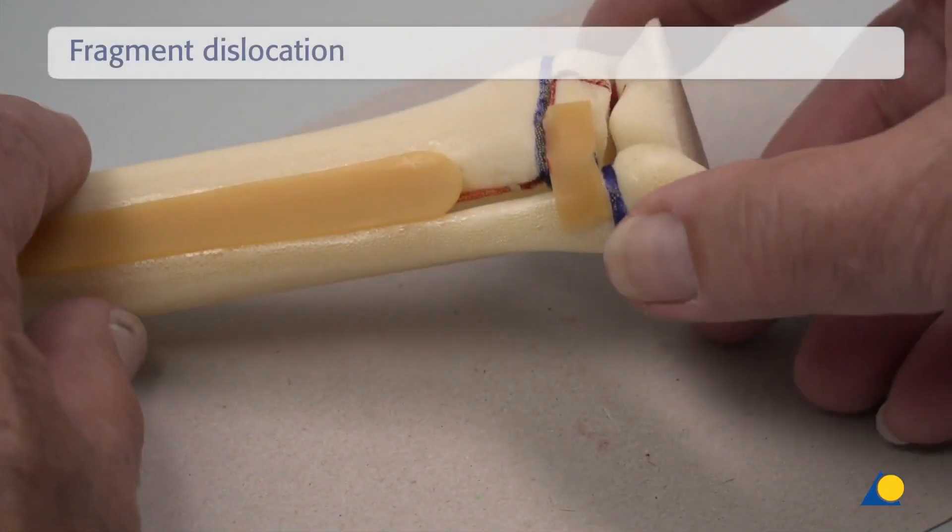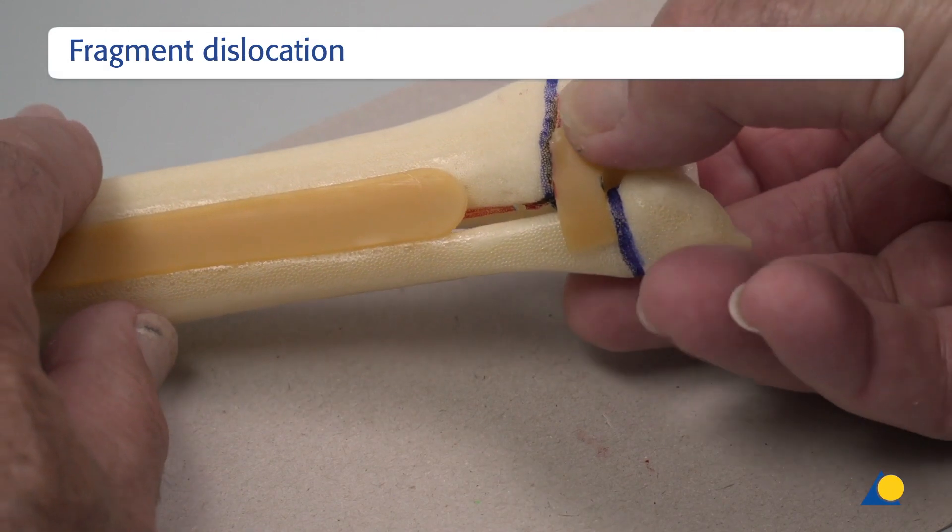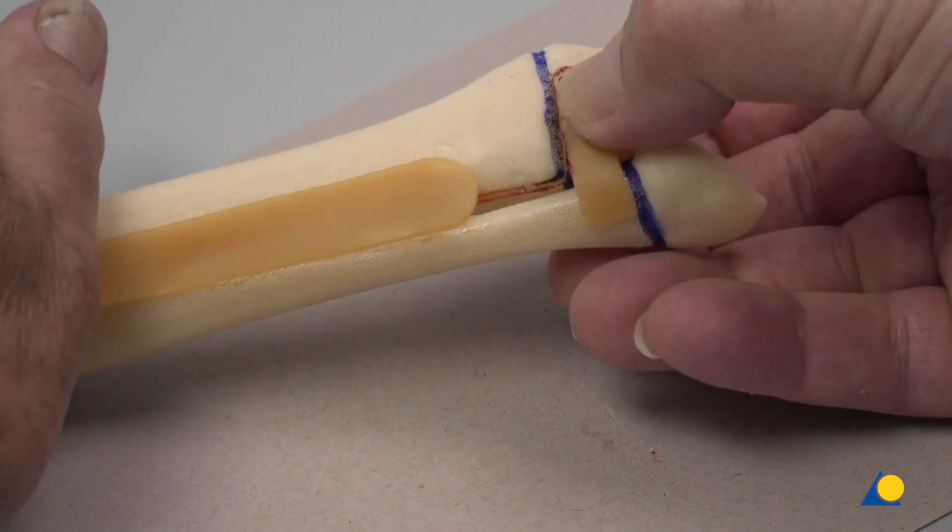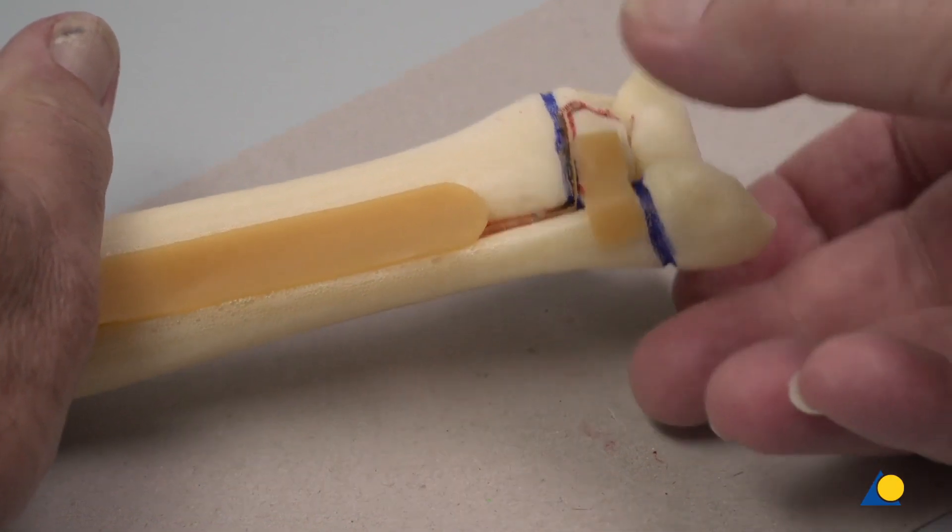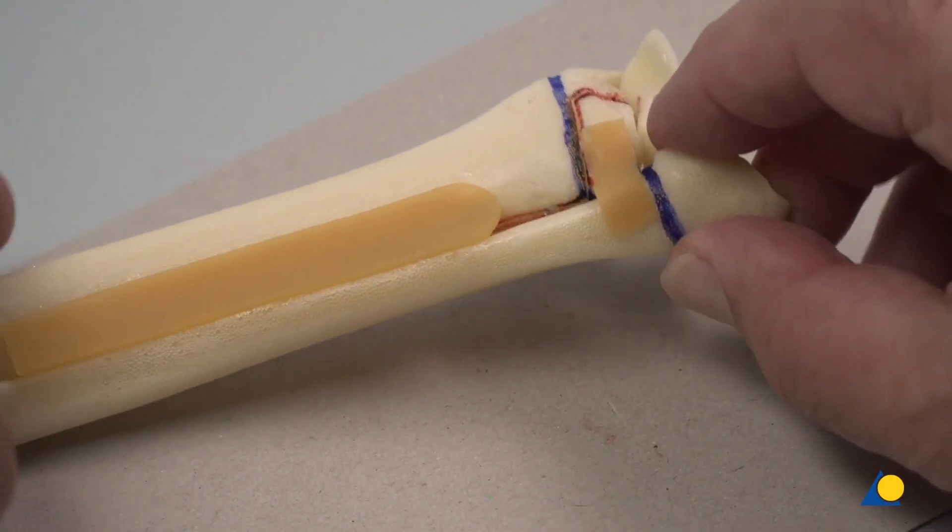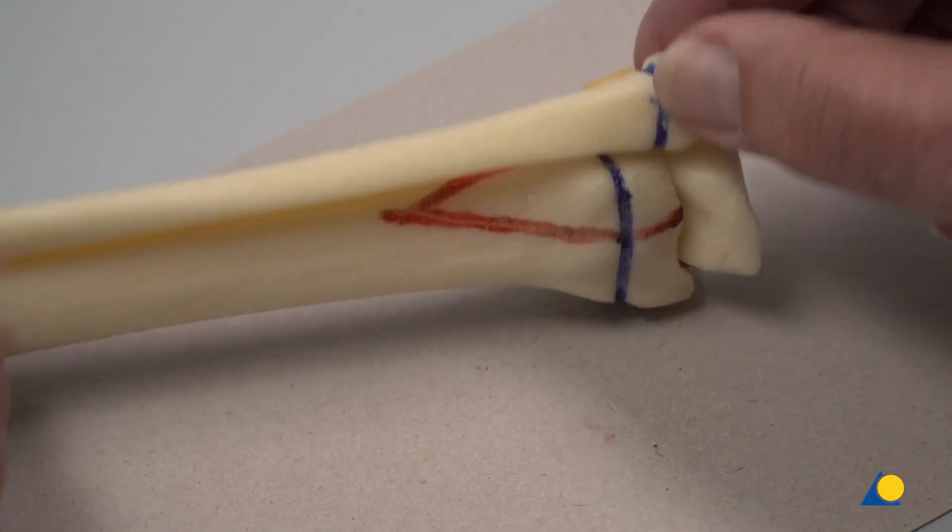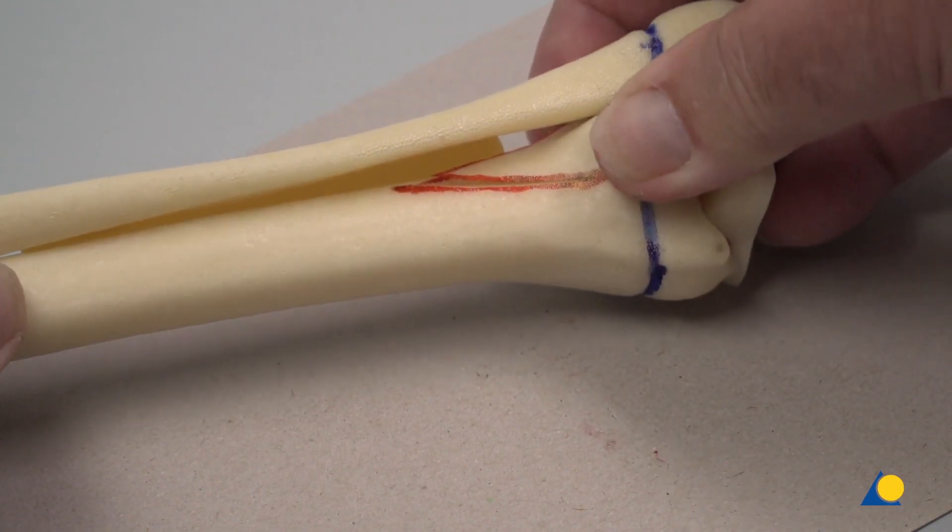The triplane fracture is a typical external rotation injury. Once the cutting procedure has been completed, the fragment is rotated externally and with an audible click, it will displace, producing the triplane fracture.